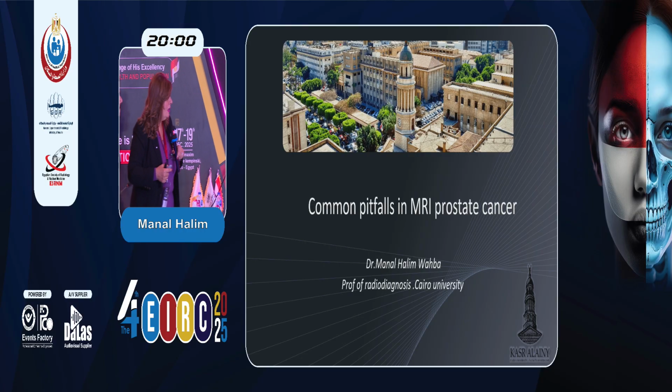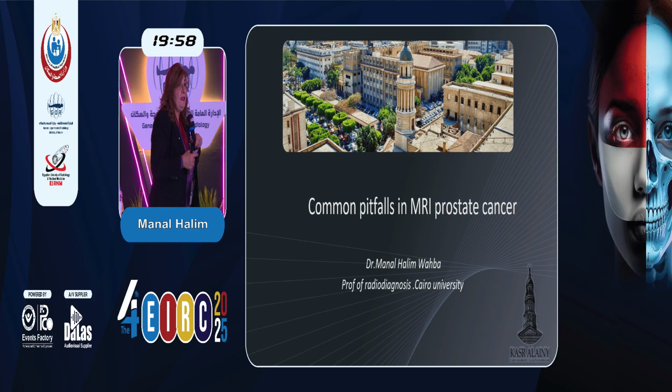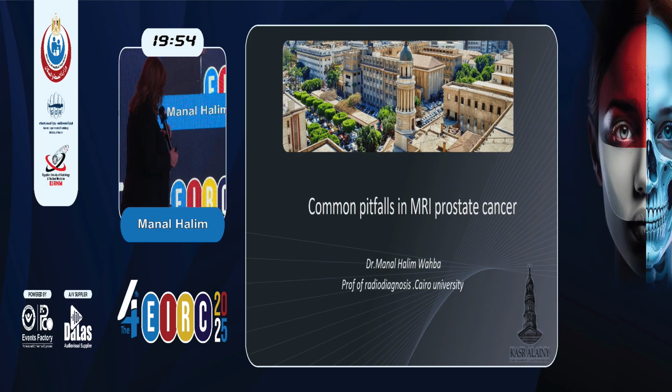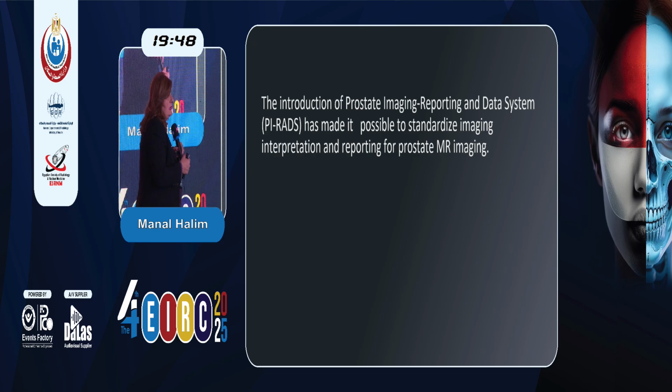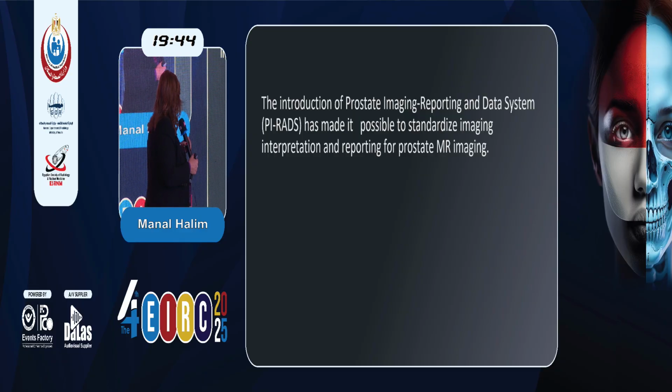I'll talk about the common pitfalls in MRI of prostate cancer. We face a lot of common pitfalls in prostate cancer, and why? Before I reply to this question, I want to say something: the PI-RADS system has made it possible to standardize imaging interpretation and reporting for prostate MRI.